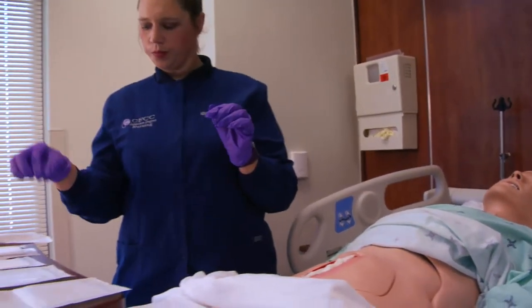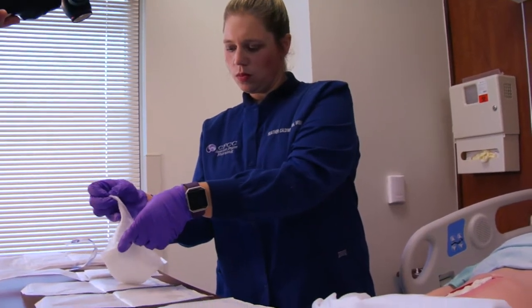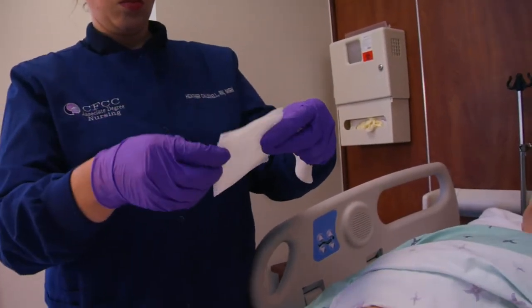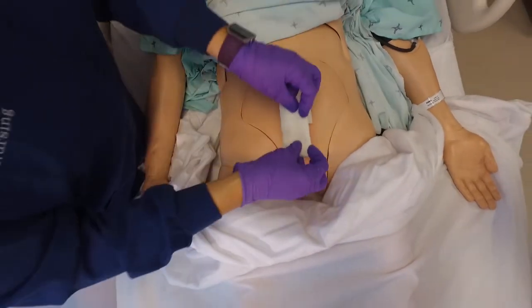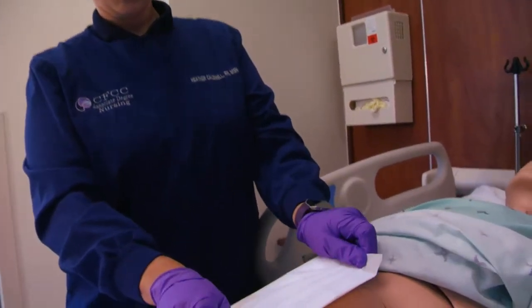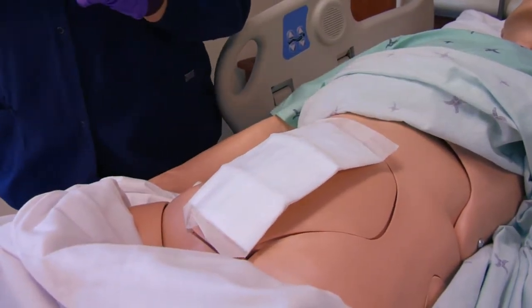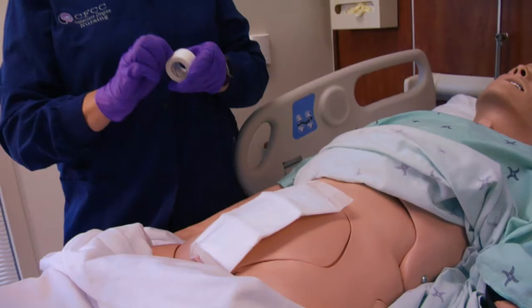The nurse applies dry, sterile gauze pads over the moistened gauze to absorb excess moisture and drainage. Next, the nurse will place an ABD pad over the dry gauze with the blue stripe up. The nurse then secures the dressing with tape on all 4 sides.